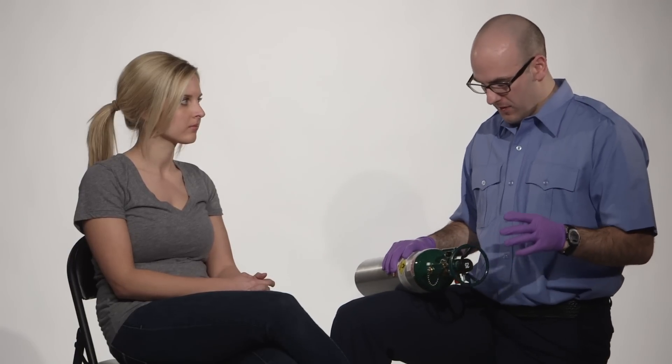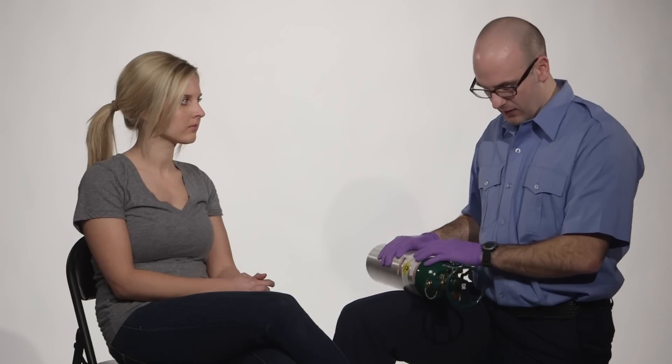BSI. Is my scene safe? Your scene is safe. All right. So I will select all the equipment I need for oxygen therapy: a tank, an O2 tank, a regulator, and a wrench.